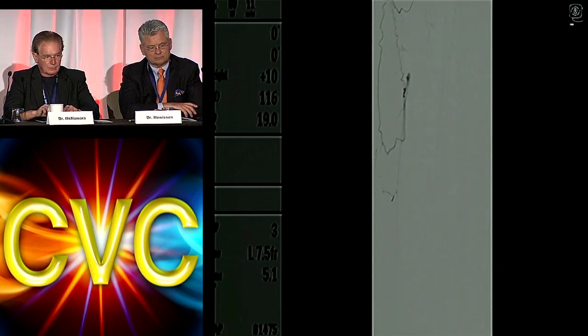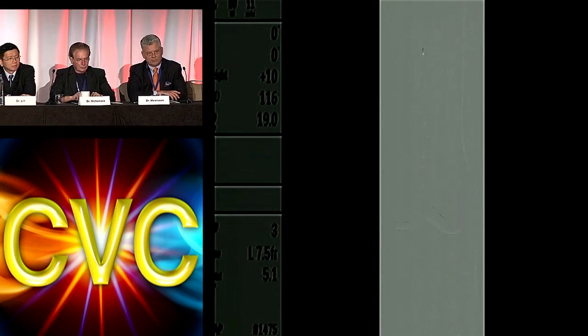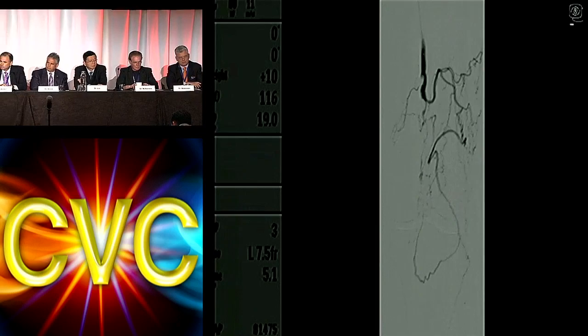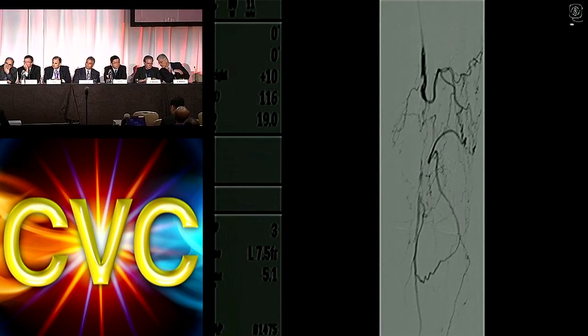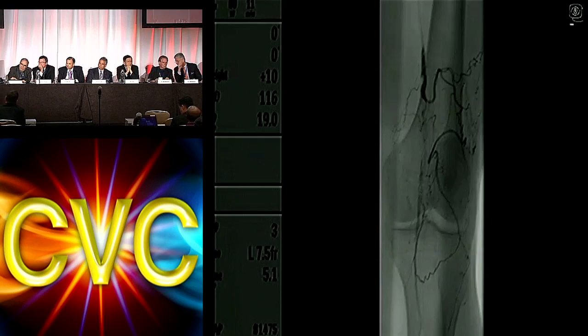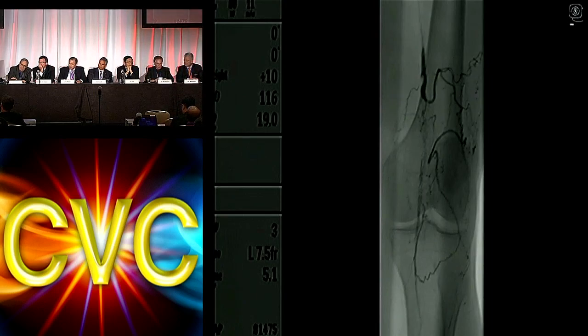So our thought was try to get across this, and we've done a debulking with calcium device before. So the question is, 5 years later, what do you expect? What do you think? Maybe Tom has a lot of IVUS experience here. But do you think we're going to find much calcium in the lumen, or do you think it's all just out in the deep wall? Actually, let me show you the calcium you can see, because you can see quite a bit there. Well, let me ask our panel what they would do. Let's start with Mark.